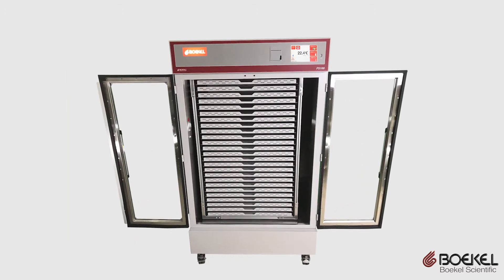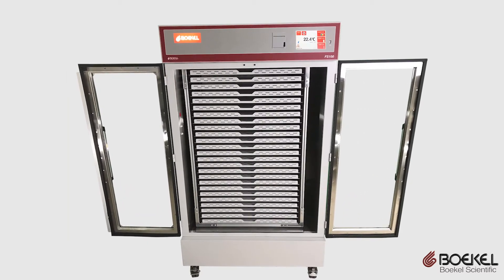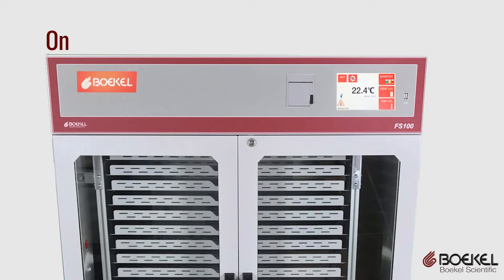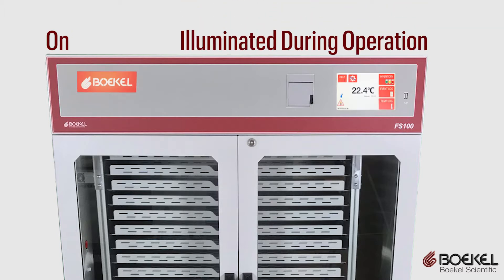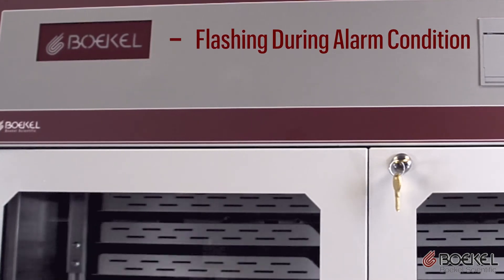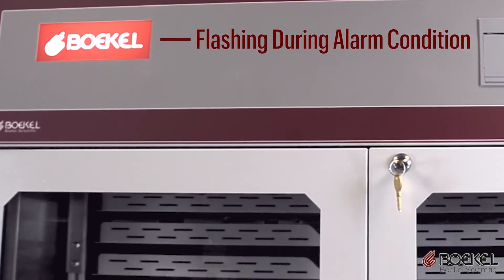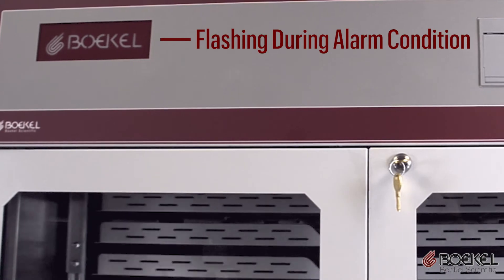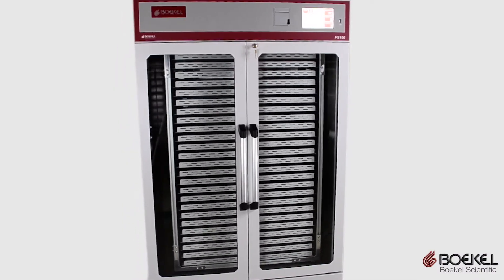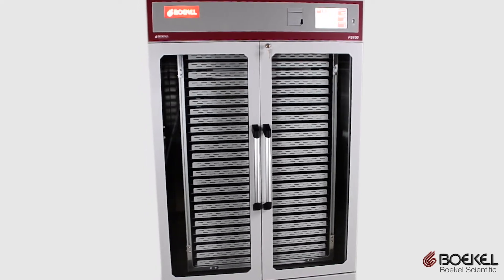Busy blood banks can be challenging to manage. Bocal Scientific understands this and created an easily visible status light. When the unit is powered on, the status light is illuminated. If the unit enters an alarm state, the light blinks. This light is visible across a large room and makes it easy to determine which unit requires attention — just another tool to help blood bankers provide life-giving products to their patients.